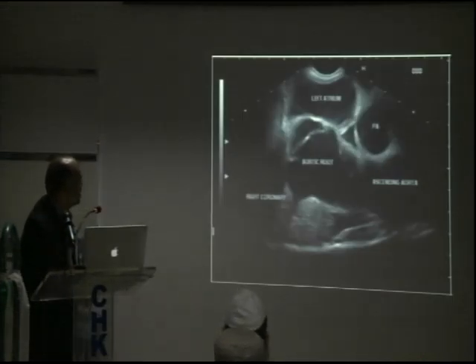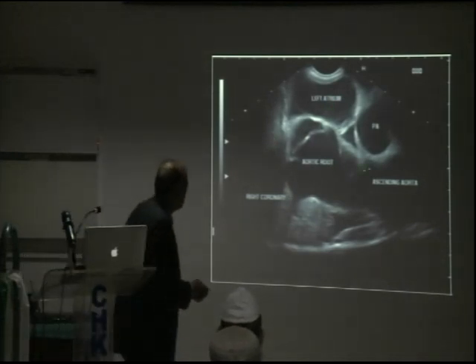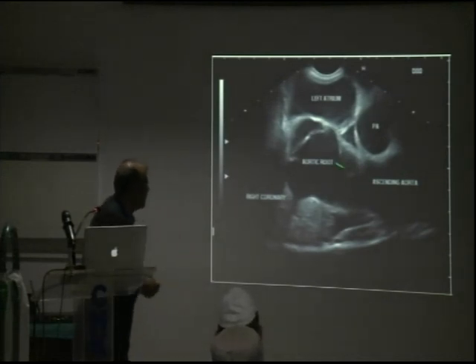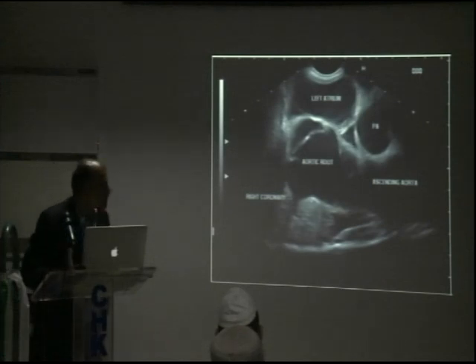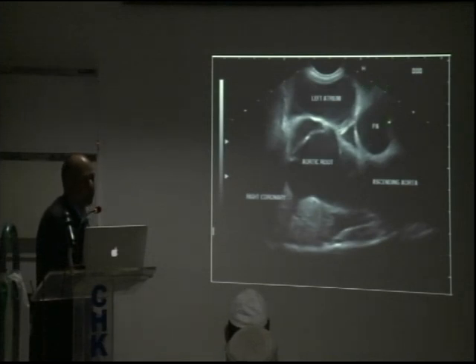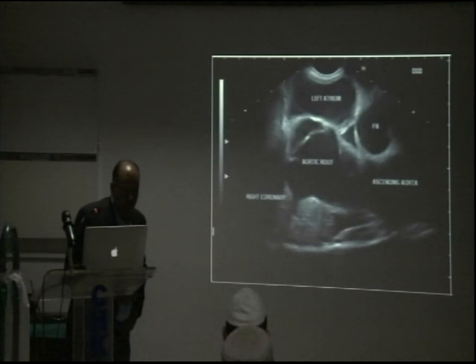All right, so this is one of the views from that. If you're good enough, you can actually look at the coronaries also, but that's besides the point. Basically, these are the views from what we talked about yesterday. What is this window? Subcarinal, not the AP window. This is the subcarinal window, below the carina. As I said, this is in the mediastinum. We are looking at the heart, all right?